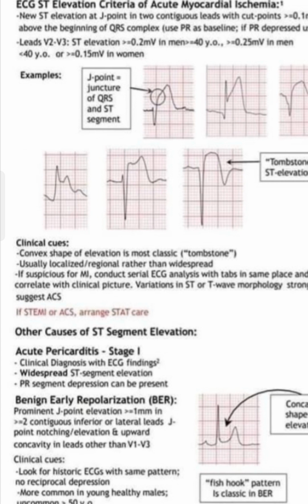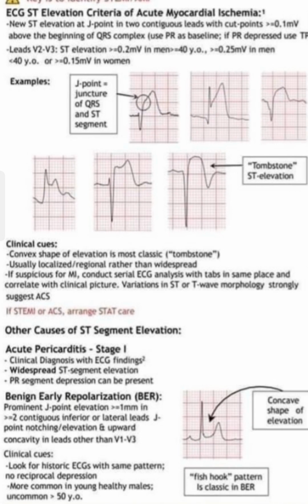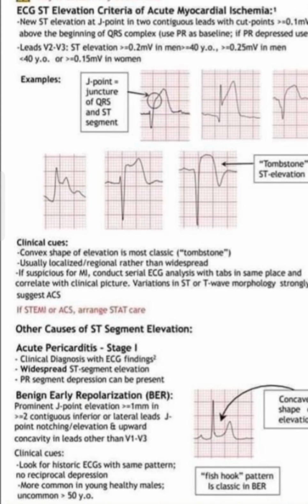Convex elevation is classic tombstone, usually localized regional rather than widespread. Do serial ECG analysis in the same place and correlate with the clinical picture for correct diagnosis.